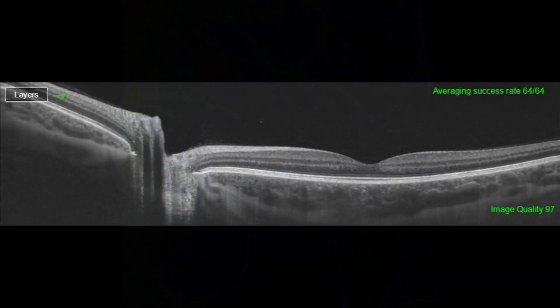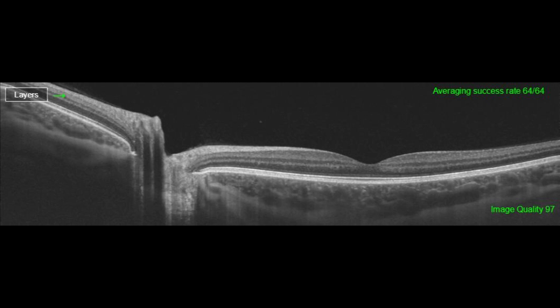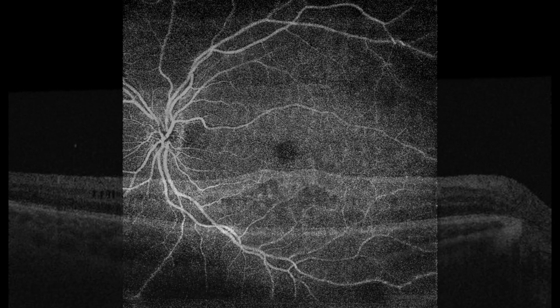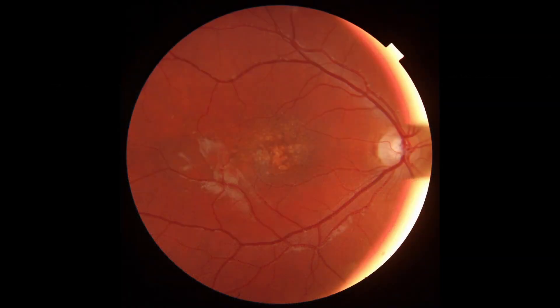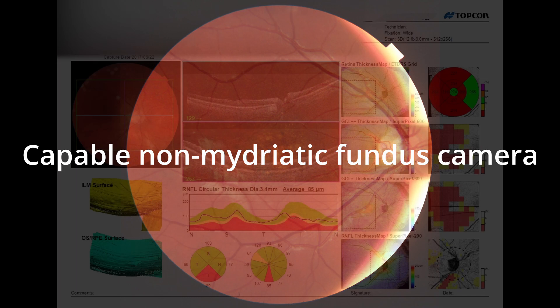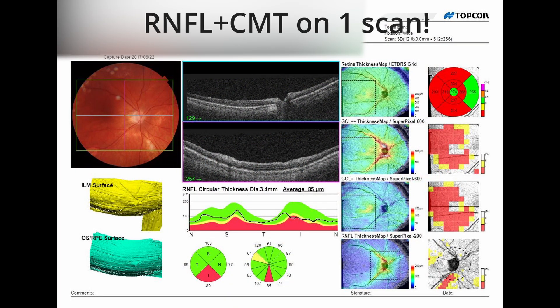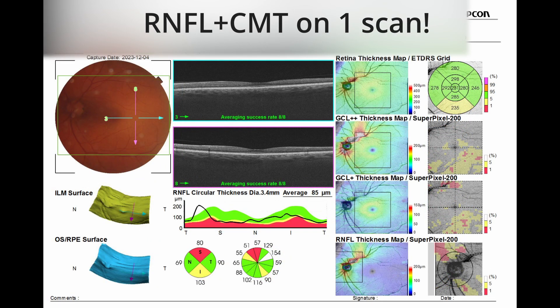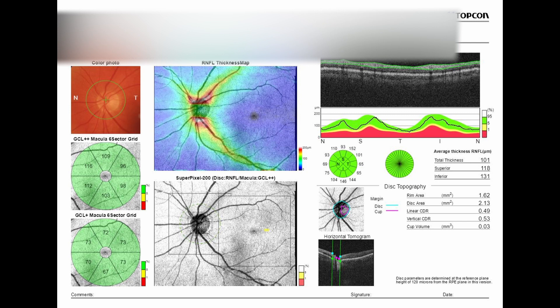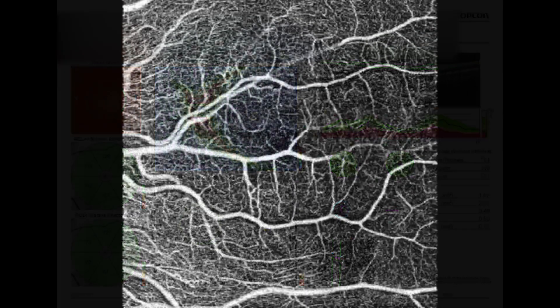Eight years ago the Triton was a game changer — the first really modern OCT. The permeability through media opacities was amazing, the ability to image under blood and blood clots in vascular AMD was remarkable, and the choroid thickness imaging was amazing. Today I wouldn't say these are really advantages compared to most modern spectral domain machines, which also offer high resolution and good permeability. I like machines with a fundus photo — it's a great idea to have co-registered fundus photo and OCT, and this one has it.